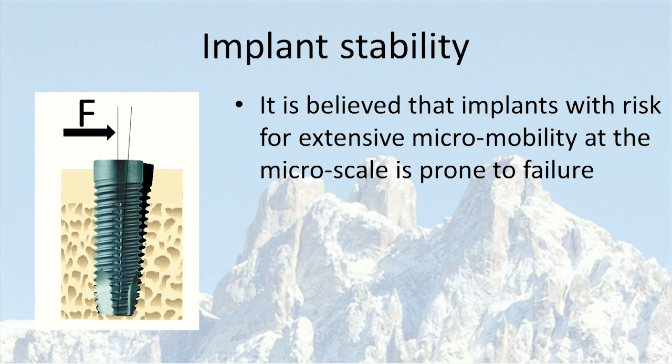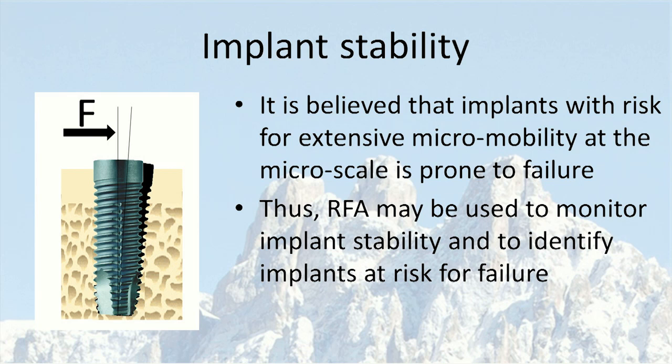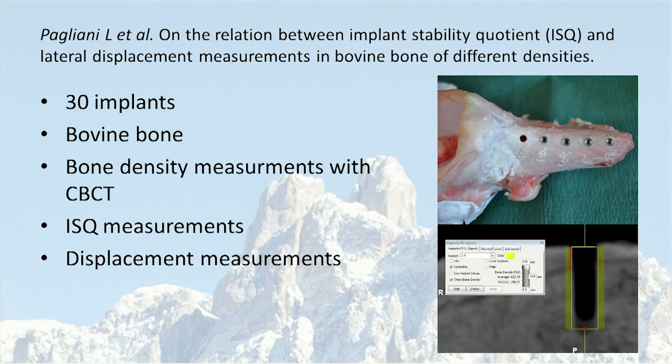So if the RFA technique is measuring displacement, the technique can of course be used to identify these implants and also to monitor development of implant stability after implant placement. So we did a simple in vitro investigation where we placed the implants into bovine bone specimens with cone beam CT.